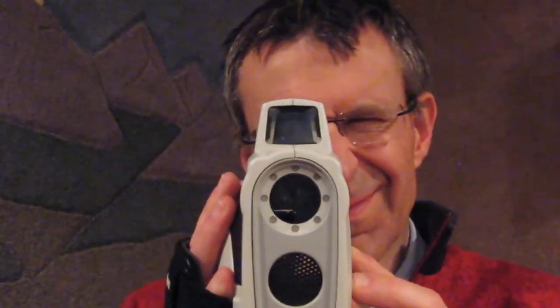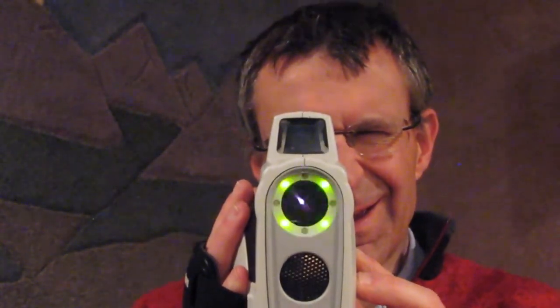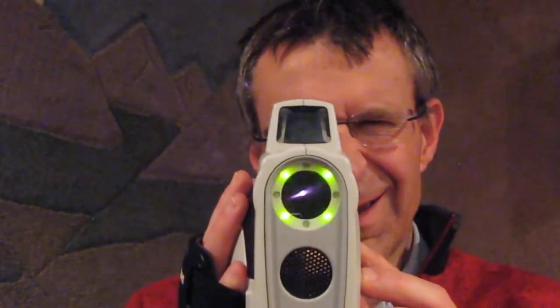We'll have to find out now. We send the information to that little printer right there, and the little printer thinks you have unequal farsightedness. So it was right — just about like this — and we get ready for that.